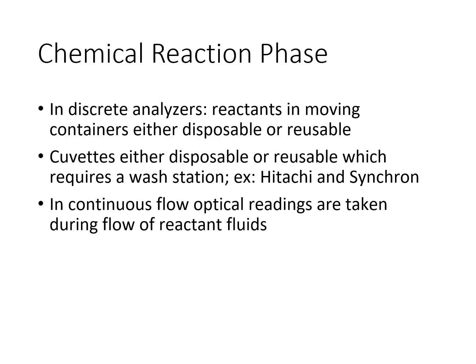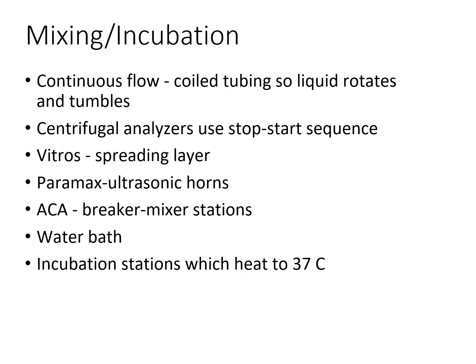In continuous flow, optical readings are taken during the flow of reactant fluids. In continuous flow, there's coiled tubing, so the liquid will rotate and tumble. There are centrifugal analyzers that use start-stop sequences. And then there are water baths as well to keep the temperature where it needs to be, for some of them, body temperature at 37 degrees Celsius.